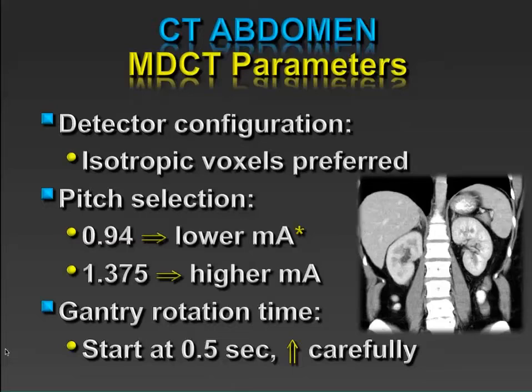So other than the impact on your archive system for the number of slices that are generated, they will look sharper if you can acquire them isotropically and then use those isotropic axial slices reconstructed at 0.625 millimeters and use those to form your coronal reconstructions.